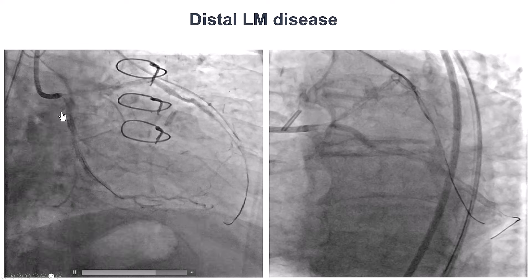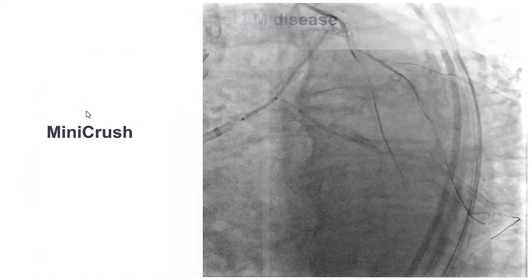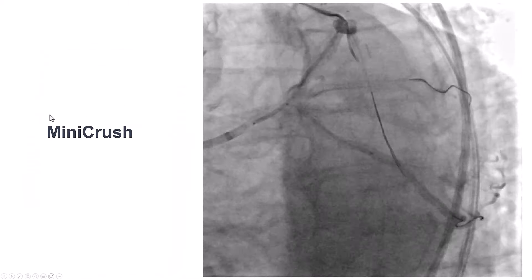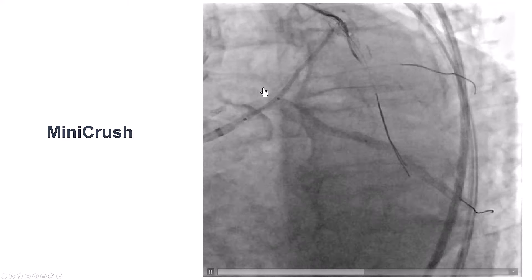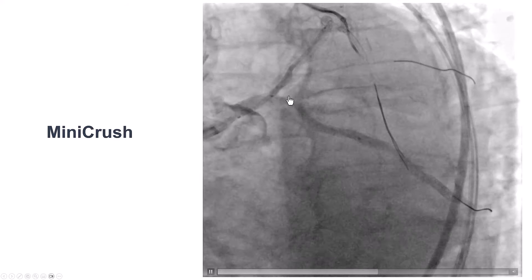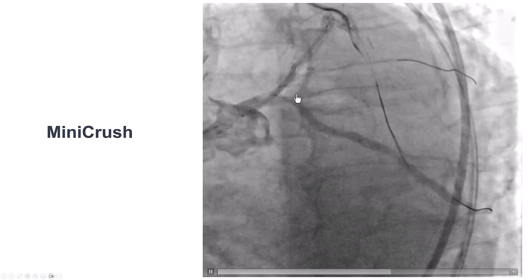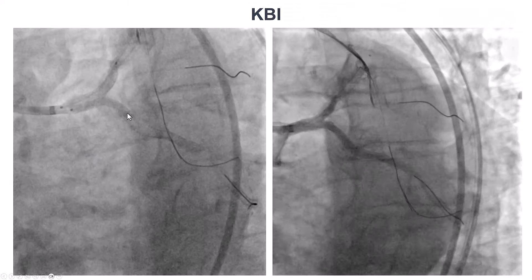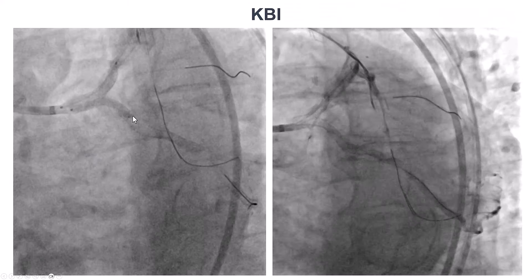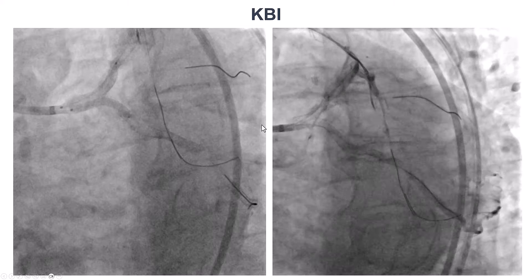There was also significant disease in the left main, LAD, and circumflex. We used a technique we almost never use — a mini-crush — which is also, in a way, a T technique because the angle is very favorable here, essentially almost 90 degrees. We deployed a stent on the side branch, then a stent in the main branch, rewired, and performed kissing balloon inflation, which provided an excellent result.